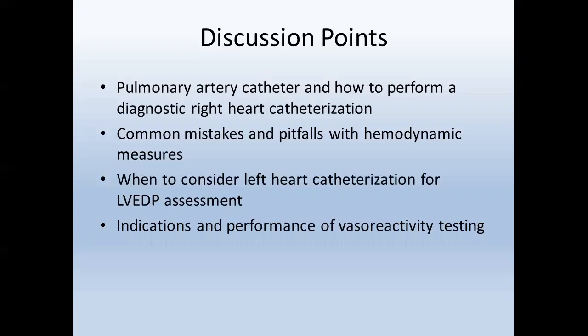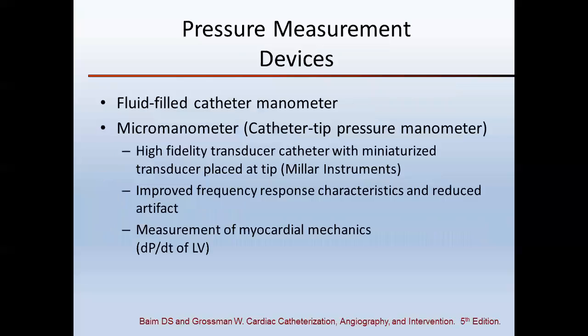We'll cover the diagnostic catheterization, common mistakes and pitfalls with hemodynamic measures, when to consider a left heart catheterization for assessing the left-sided pressure, and what are all the indications and how to perform a vasoreactivity study. And I think that's where most of the confusion is: what drug to give, when to give, and all those things.